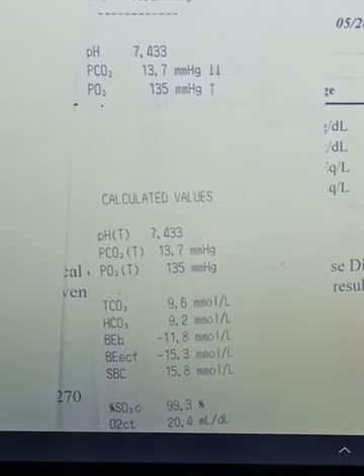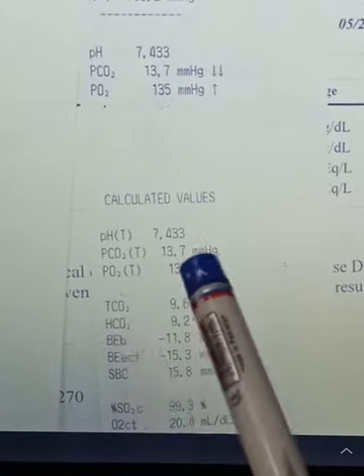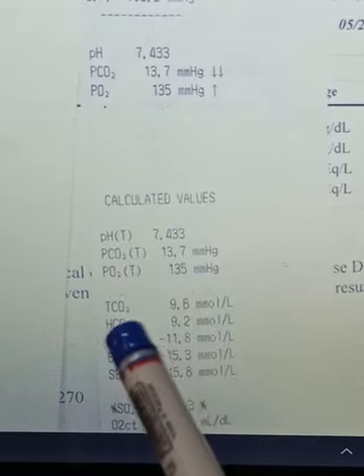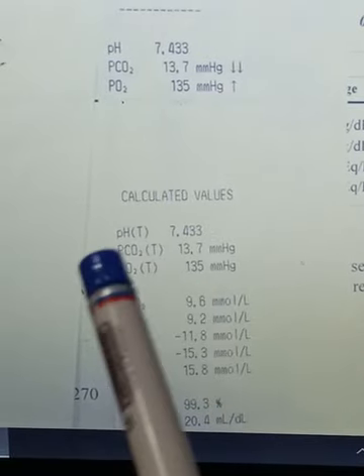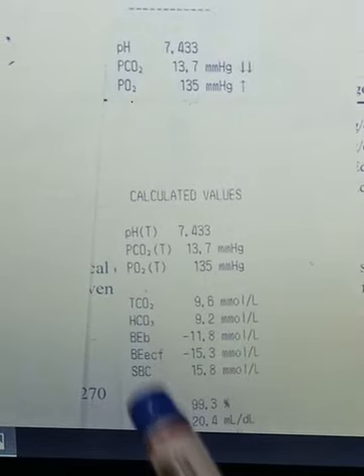What do you think? No, it is not normal. Look at the bicarb value and look at the CO2 value. A normal pH with abnormal CO2 and bicarb values means a mixed acid-base disorder. So the pH is of course normal, but we have to focus on the CO2 and bicarb. Look at the CO2, that is decreased, and look at the bicarb, that is also decreased.